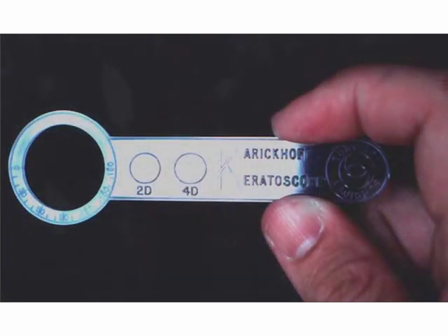This is another sort of intraoperative keratometer. What you do is hold this ring over the patient's cornea, and you look at the reflection of the ring on the patient's cornea. And of course, like all the other keratometers that I show you, you have to make absolutely sure that you're holding this ring parallel to the floor. Otherwise, if you tilt the ring a little bit, then you're going to recognize a cylinder that's not there.